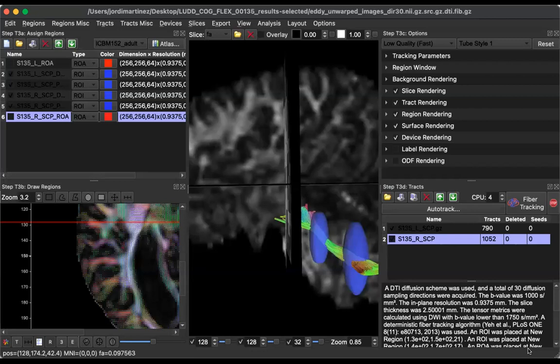I did it based off of some tractography studies that used the uncinate, because we were specifically having problems tracking the uncinate because of the huge curve it has with a low angular threshold. But the one that you cited in your 2019 paper used the 30 degrees because apparently it resolves crossing fibers better in the MCP and SCP. With those tracks, I didn't have any problem with the 30-degree parameter. But with the uncinate, I had lots of issues. So that's why we changed it.